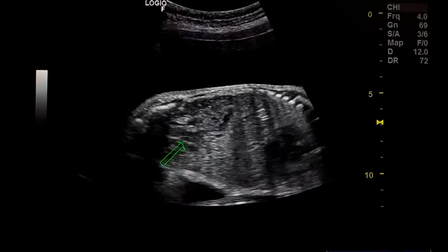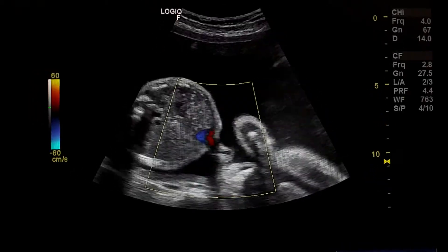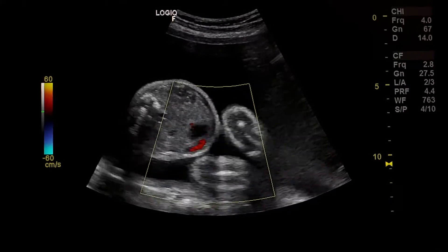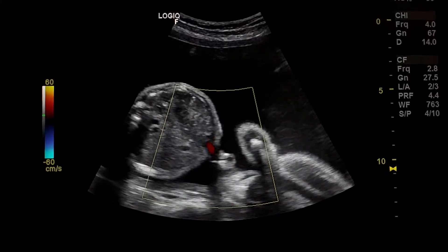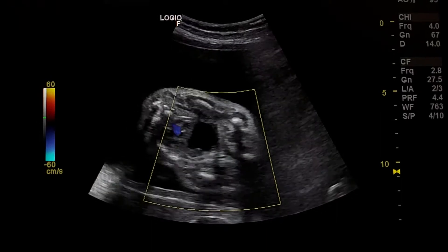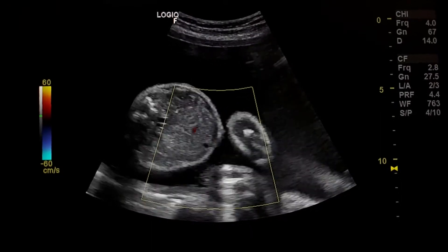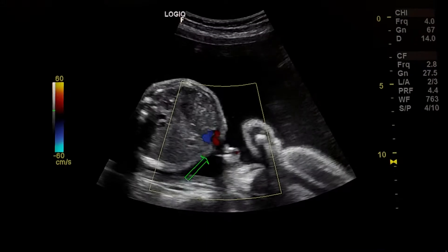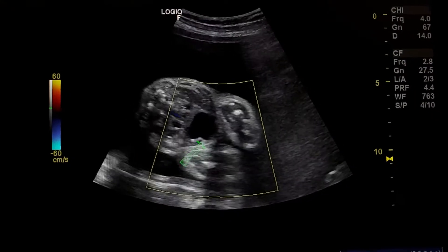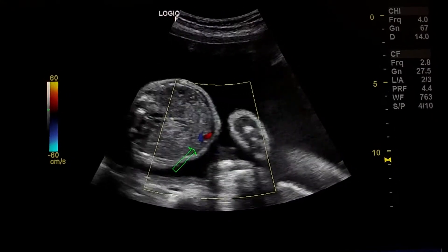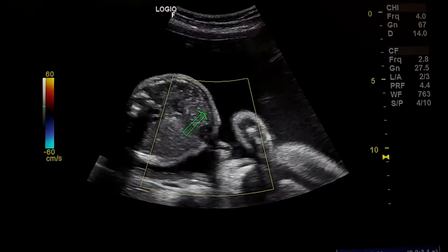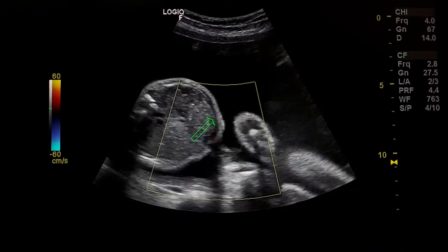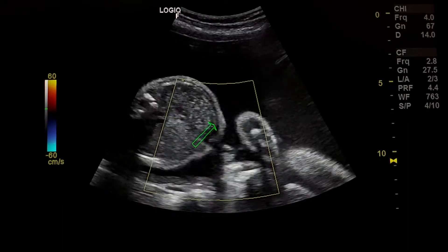Urinary bladder is normal. By scanning the urinary bladder with color Doppler, we see a single umbilical artery — only one artery on the right side, no artery on the left side, lateral to the urinary bladder.